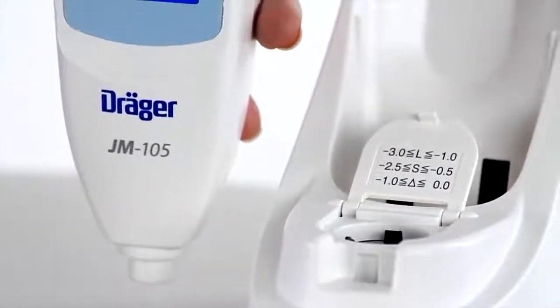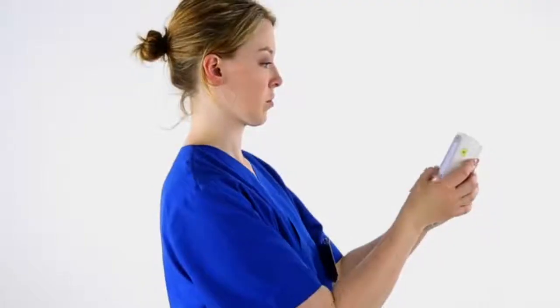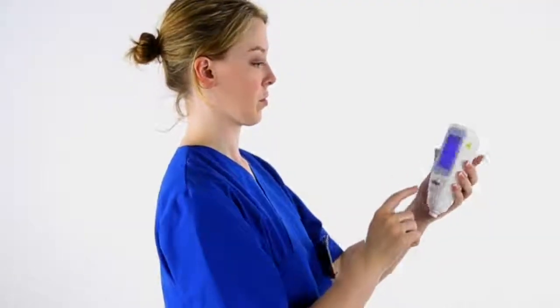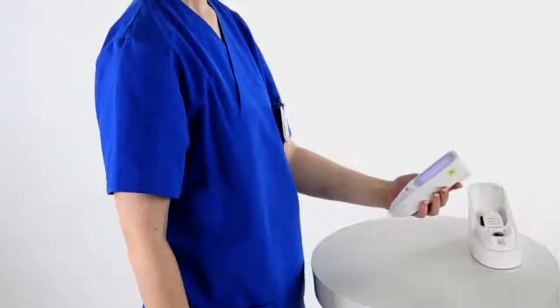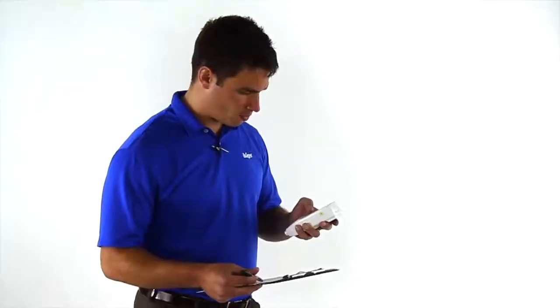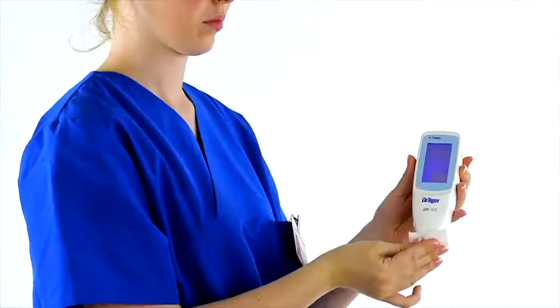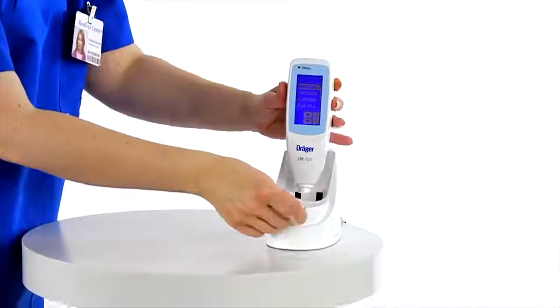If any of the three values are not within these reference ranges, clean the probe and the light checker surface with alcohol and repeat the light check procedure. If, upon repeating the check procedure, any of the values displayed on the JM105 are still outside of the reference ranges, do not use the JM105 and contact Draeger customer service. When finished, clean the probe of the JM105 and return it to the docking station.